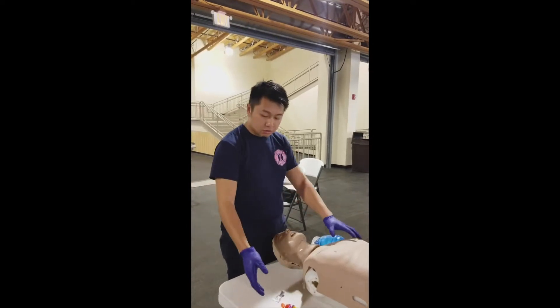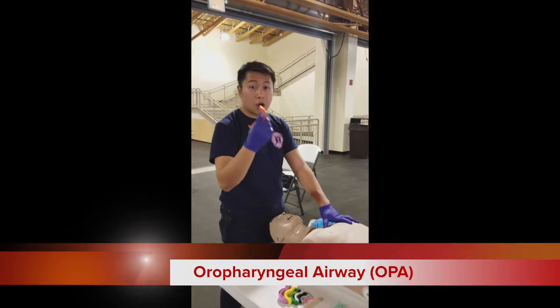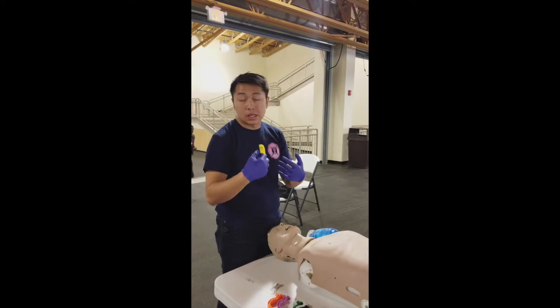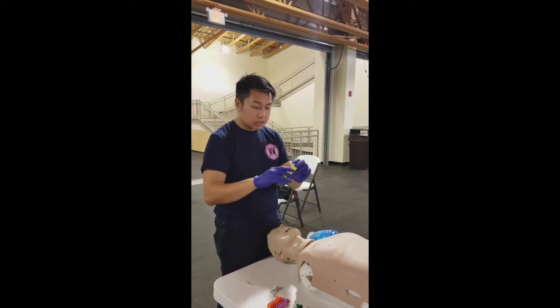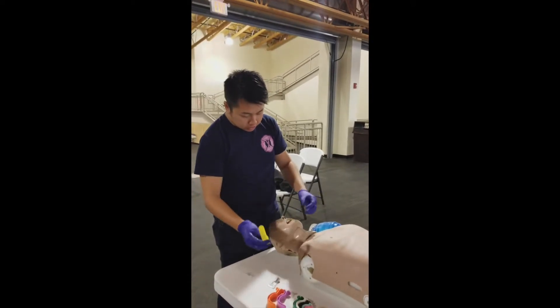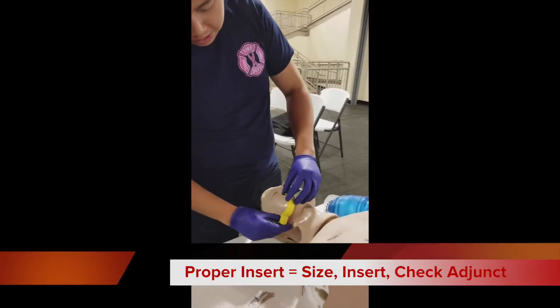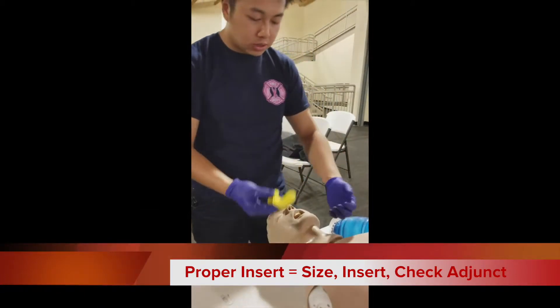The first piece of equipment I'm going to demonstrate is the oropharyngeal airway, or the OPA. We use these in an apneic patient — a patient that is not breathing and that does not have an intact gag reflex. To measure it out, we're going to take this from the corner of the mouth to the angle of the jaw, make sure it's in line.